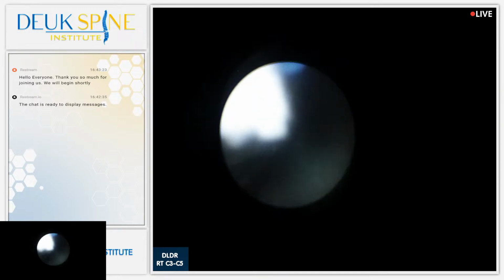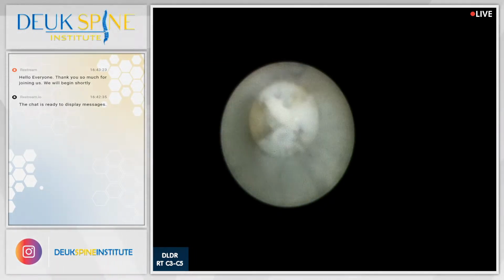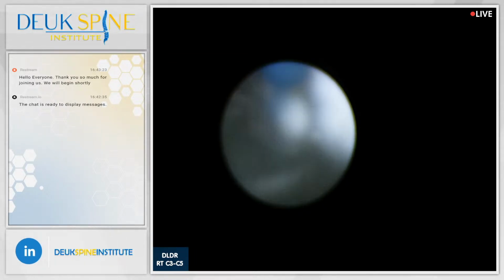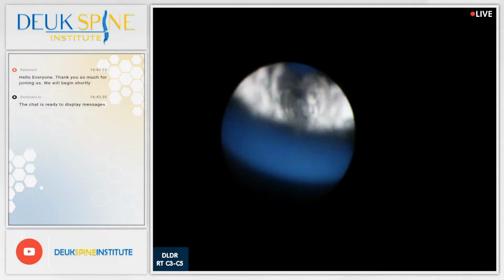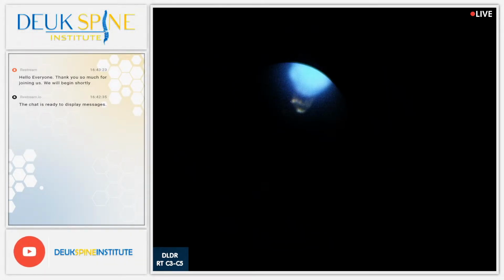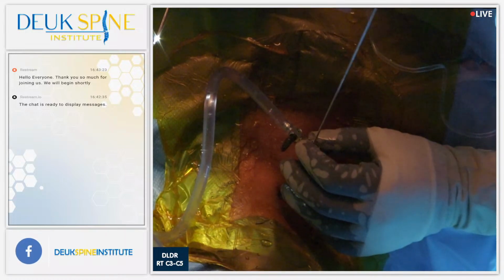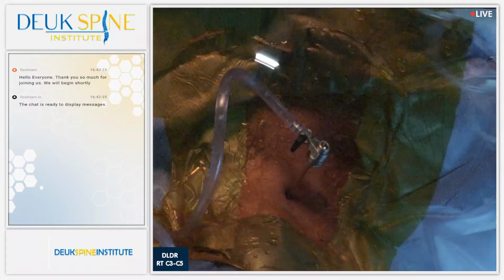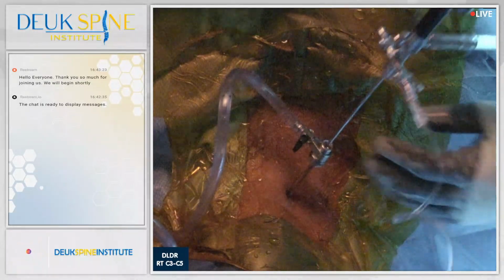All right. So you've been watching our video on facet pain. Again, that's not a problem this patient has, but we like to teach while we're doing surgeries, and I think it's important that people are aware of different causes of pain. In this case, this patient has a lot of disc herniation. We've been taking a bunch of pieces out with the grabber, and while you guys are watching that video, and unfortunately they're pushing on his spinal cord. There's another piece. He kind of blew this disc out pretty bad. I'm hoping I can get all the pieces out.